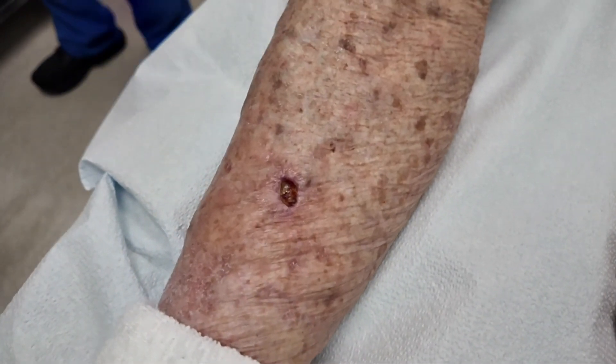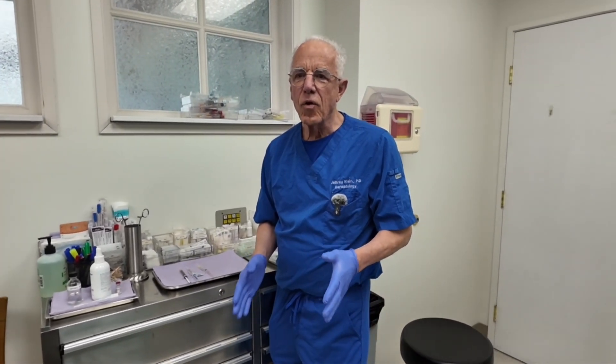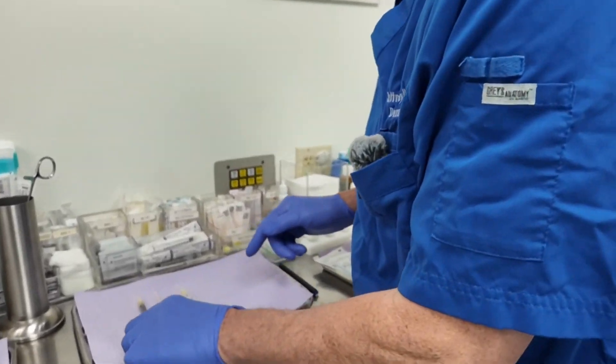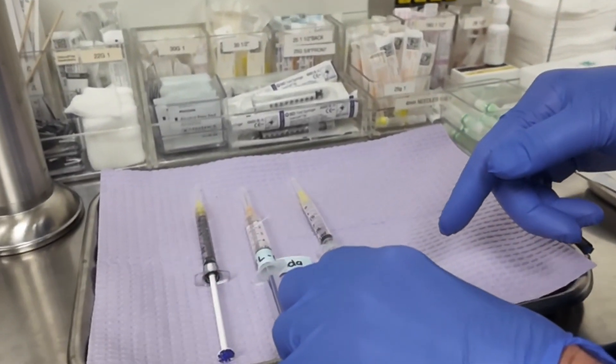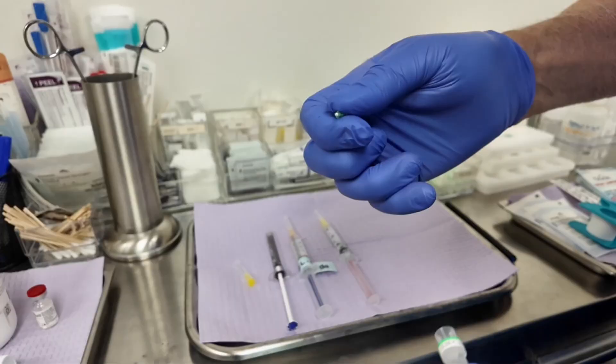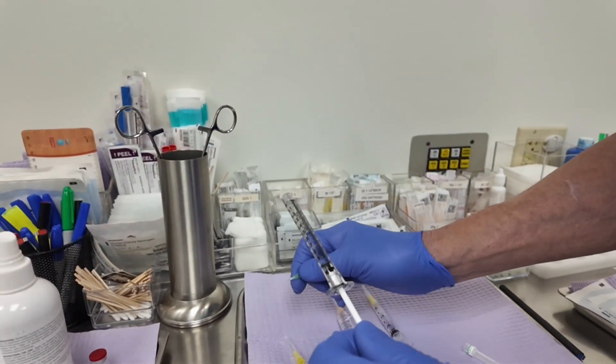We're going to do Mohs surgery today using tumescent antibiotic delivery as a form of local anesthesia. These are the drugs I'm using. The first injection is very painless — I'm using the tiniest little needle available, a 32 gauge needle.